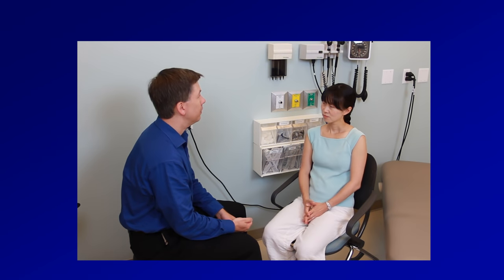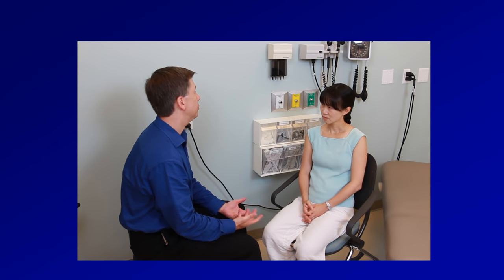After measurement is complete, don't forget to tell the patient the result, as they will likely be anxious to know it.